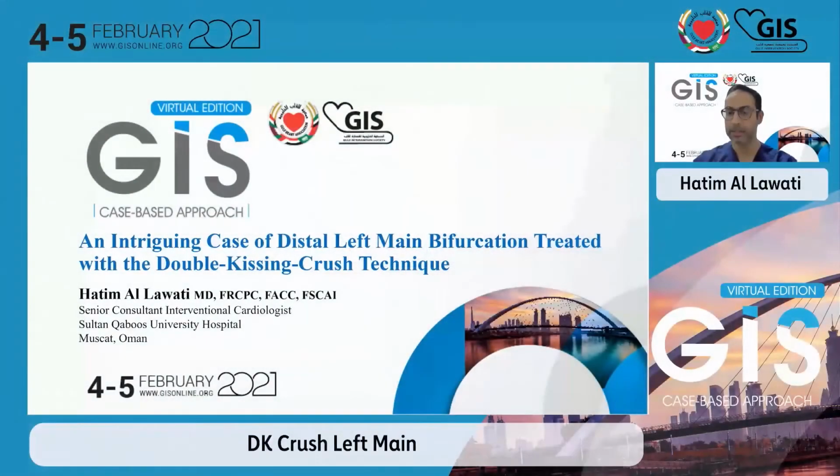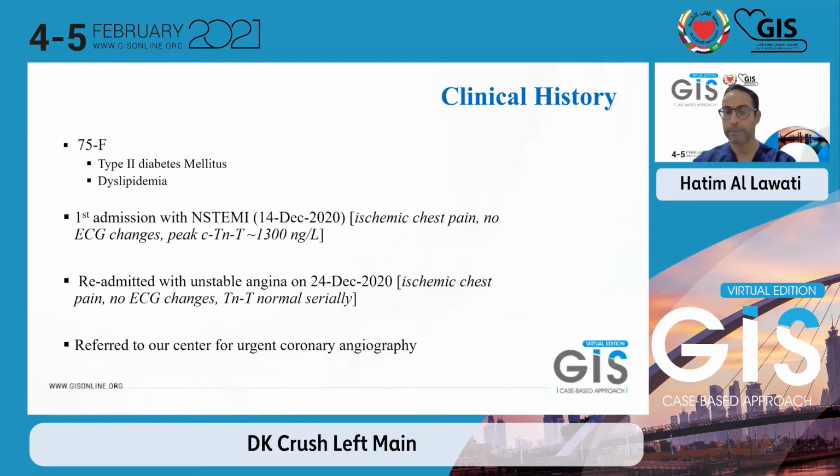Hello and greetings. I'd like to thank the organizing committee of the Gulf Interventional Society for inviting me to share my experience with this intriguing case of distal left main bifurcation that we ended up treating with a double kissing crush technique. My name is Hatim Lawati, and I'm from the Sultan Qaboos University Hospital in Oman.